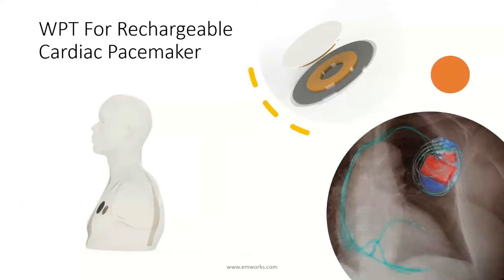This technology of wireless power transmission has been used since 1958 to charge batteries of pacemakers. But this type of pacemaker was left out for several reasons, like the charging process that had to be repeated every few days and the short service life of the batteries used at that time. Now, thanks to advances in technology, the interest in pacemakers based on rechargeable batteries is renewed. This kind of pacemaker can help reduce complications that can be caused by surgeries during pacemaker replacement. It reduces the risk of infections and improves the quality of life of the patient.